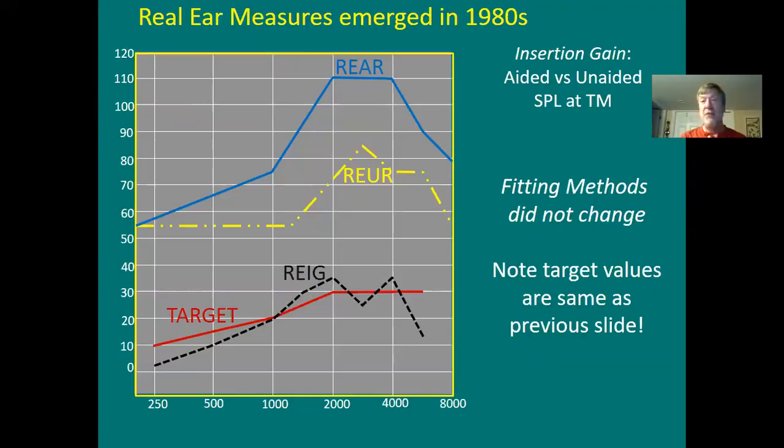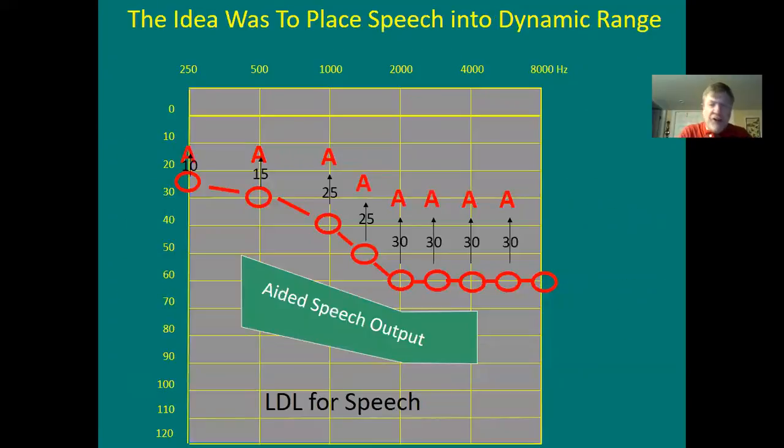That's what it did. Just made it quicker. Candy is dandy, but liquor is quicker. Okay. That's all it is. A change in method by which to verify, to prove, are you getting with the hearing aid what the fitting method said you should get?